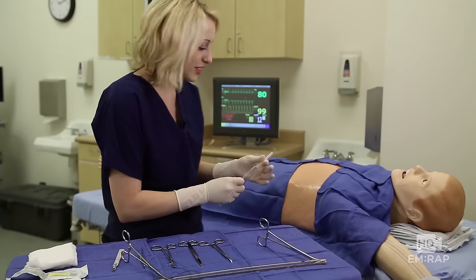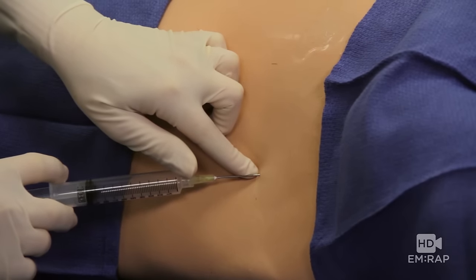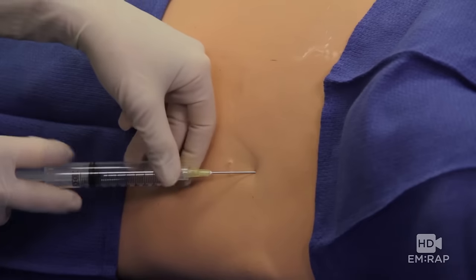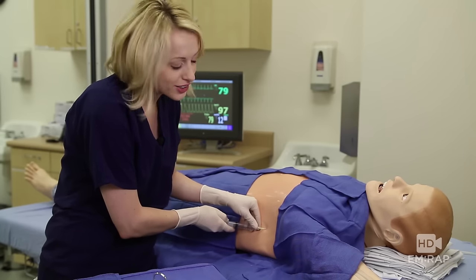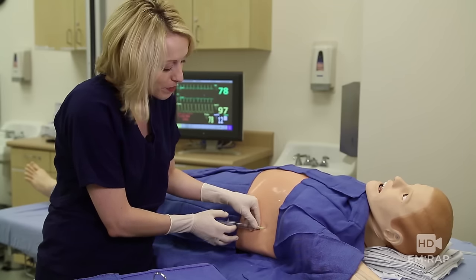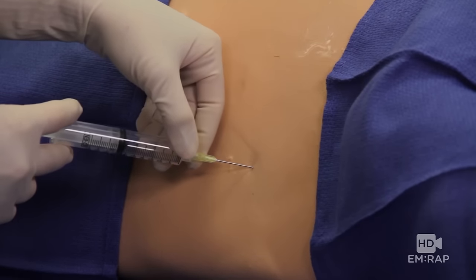Now let's anesthetize the skin. Make a wheal at the skin and then aspirate as you insert the needle. You'll know when you get in the pleural space because you'll get a gush of air or fluid back in the syringe. Then inject liberally as you withdraw the needle.